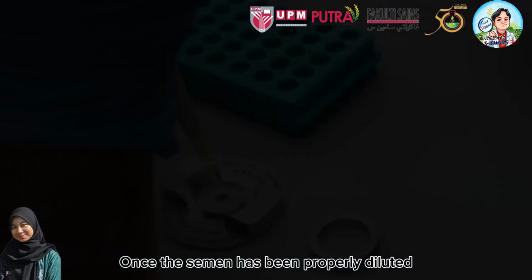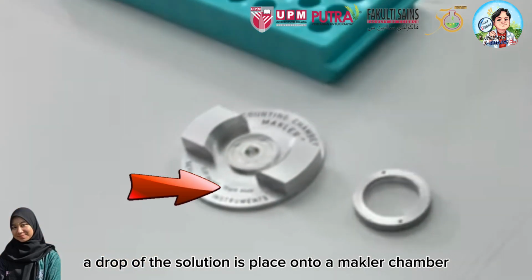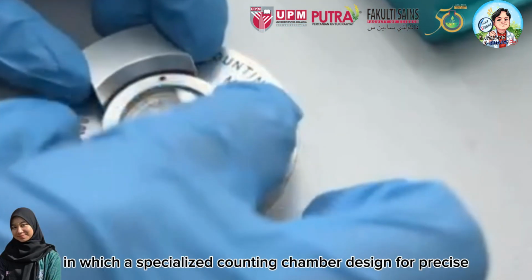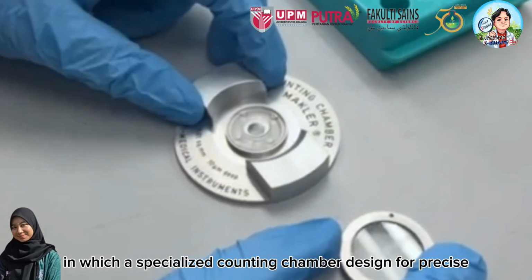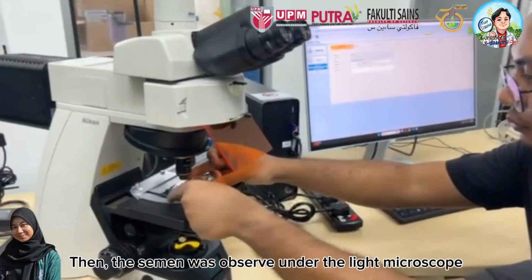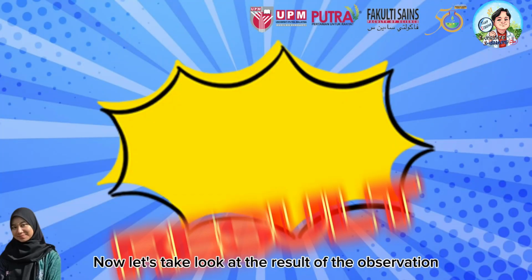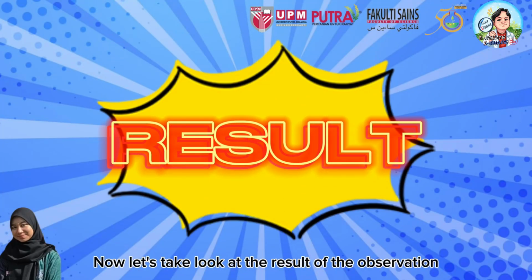Once the semen has been properly diluted, a drop of the solution is placed onto a Makler chamber, a specialized counting chamber designed for precise sperm analysis. Then the semen was observed under the light microscope. Now, let's take a look at the result of the observation.